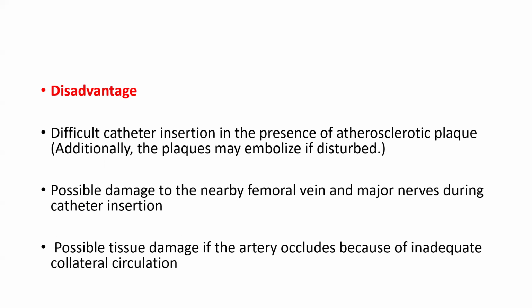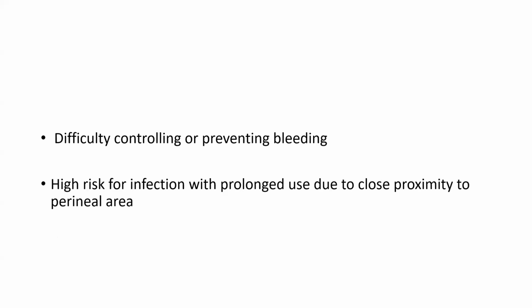Then there can be possible tissue damage if the artery occludes because of inadequate collateral circulation. Then there will be difficulty controlling or preventing bleeding. Then there is a high risk of infection with prolonged use due to close proximity to the perineal area.